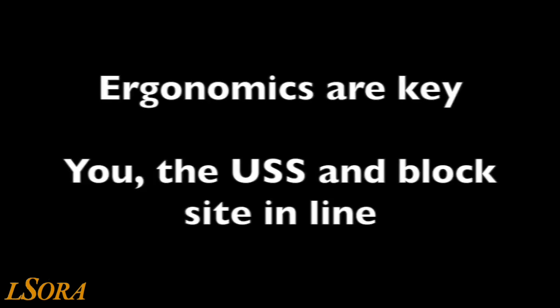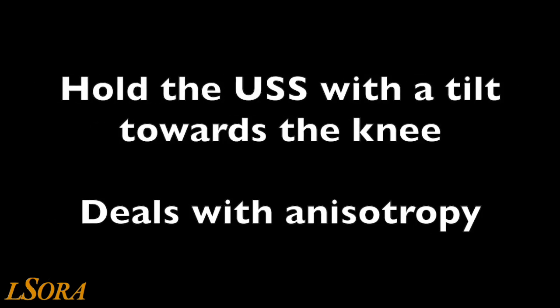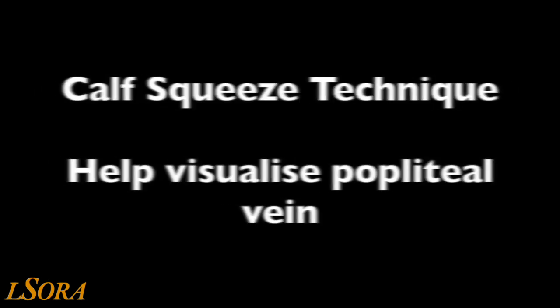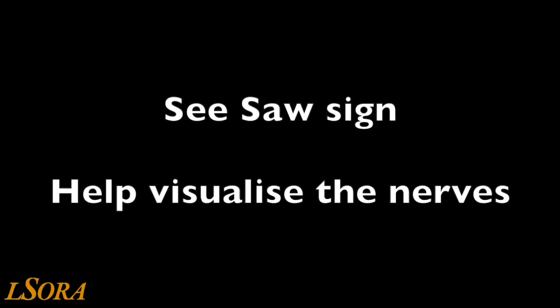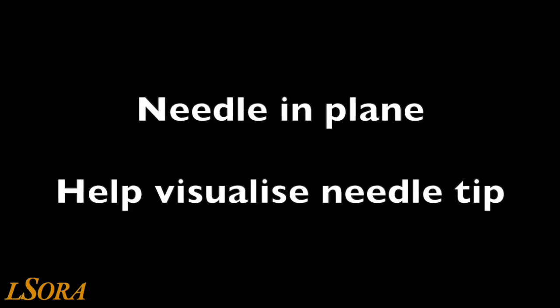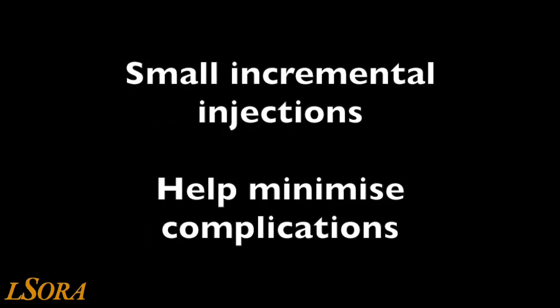Have the ultrasound probe with a slight plantar angulation to account for anisotropy and optimally visualise the neural structures, which are often not lying at 90 degrees to the skin. If required, use the calf squeeze technique to visualise the vascular structures below the nerve, and use the toe wiggle or the seesaw sign to identify the neural structures. We recommend in-plane needling to ensure optimal needle tip visualisation throughout the procedure, and always administer the local anaesthetic in small incremental injections.